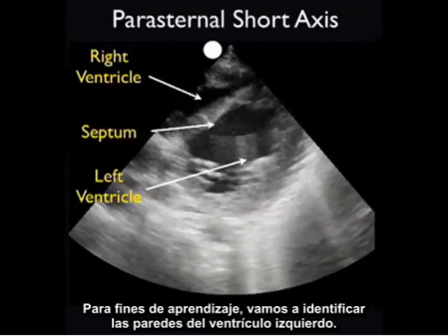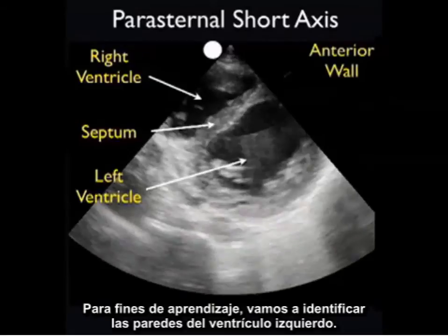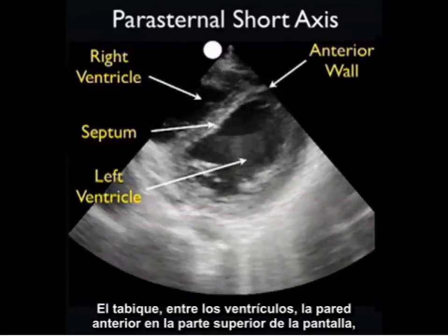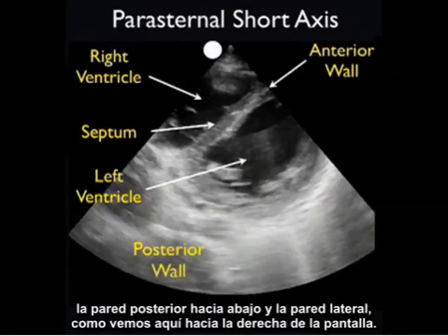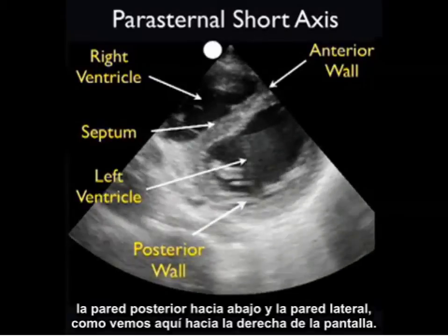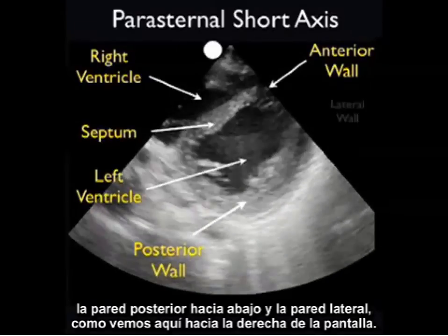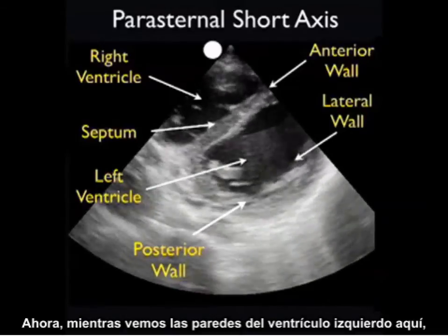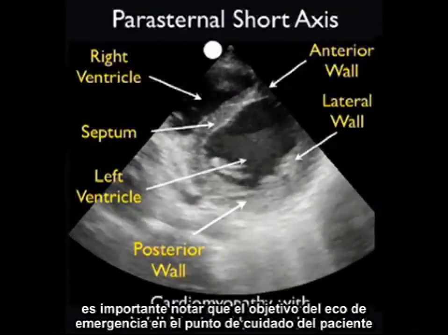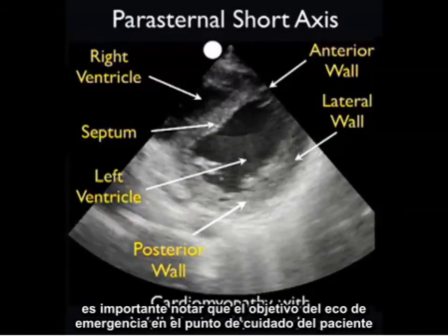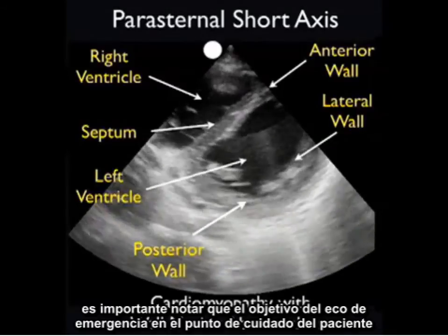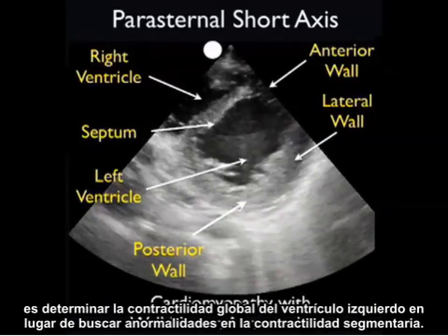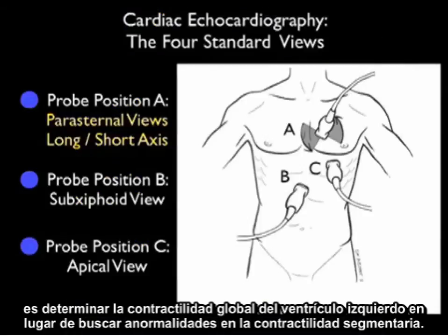For learning purposes, we'll identify the walls of the LV: the septum in between the ventricles, the anterior wall to the top of the screen, posterior wall to the back, and the lateral wall as shown here towards the right portion of the screen. While I show the walls of the left ventricle here, it's important to realize that the goal of emergency echo at the bedside is to determine overall left ventricular contractility rather than looking for segmental wall motion abnormalities.